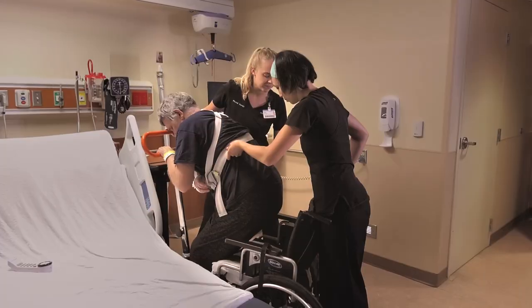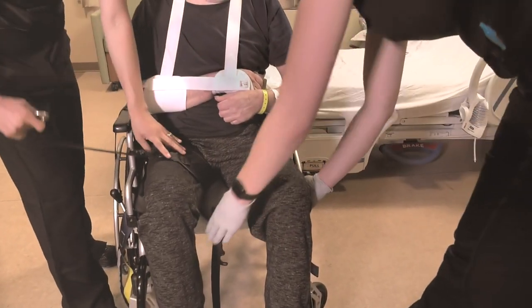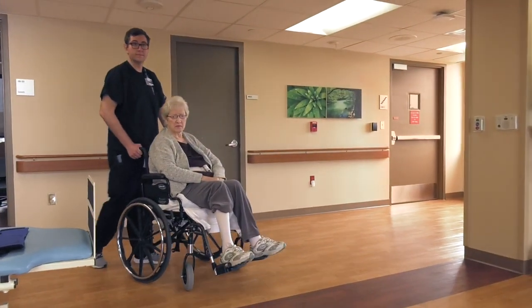Transfer the patient to the wheelchair. Adjust the inguinal straps between the patient's legs, making sure that they are not twisted. Transport the patient to the therapy gym.